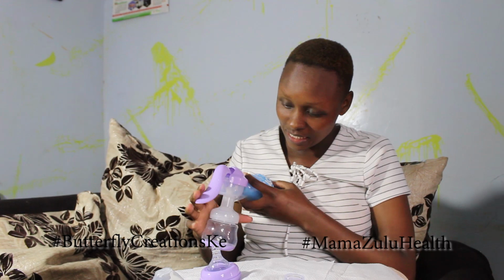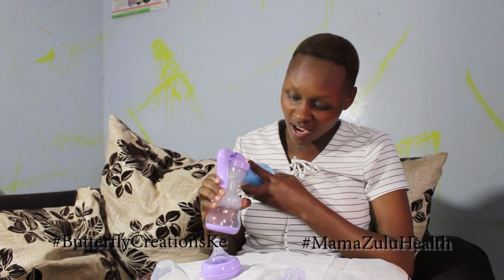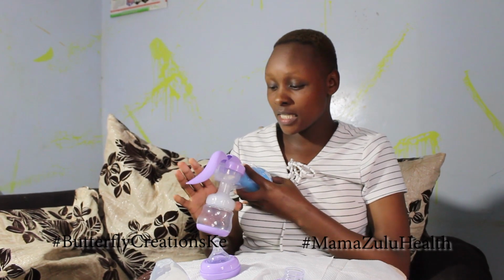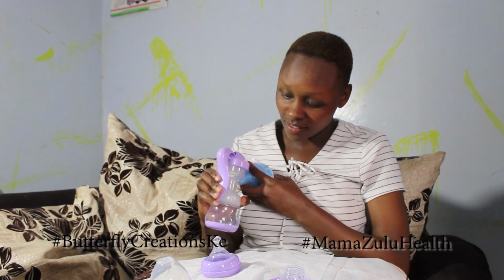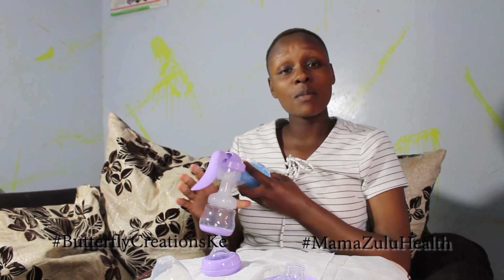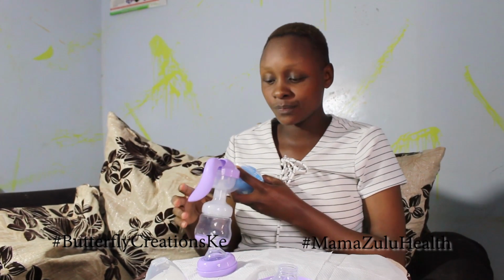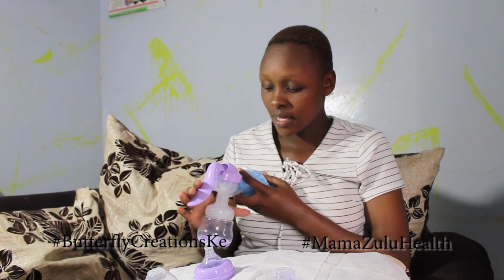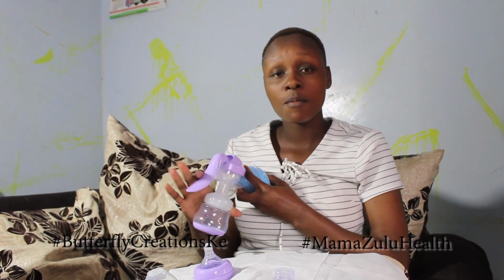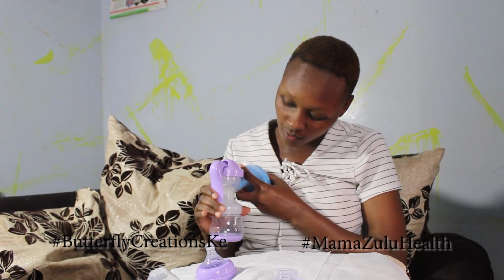You don't have to apply that much pressure. So let's say this is it. You apply pressure as far as it can go, then you release, then again as far as it can go, release, and the third time. That way the milk starts coming out, flowing continuously. And then you can do continuous moves.